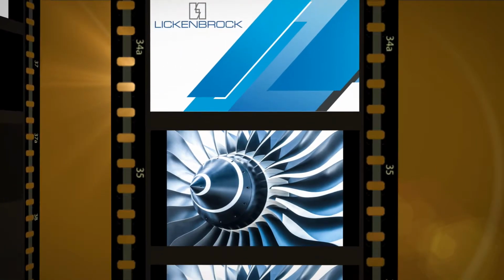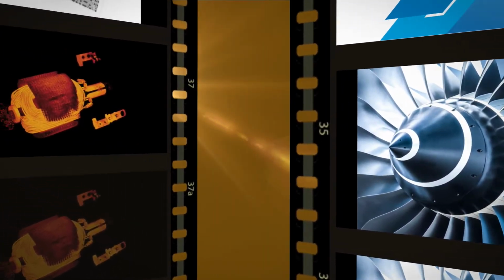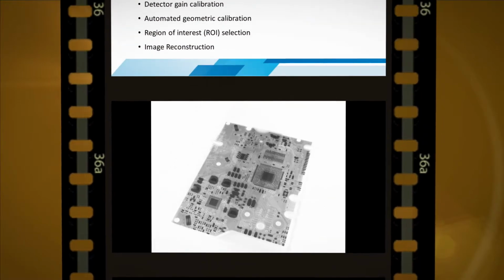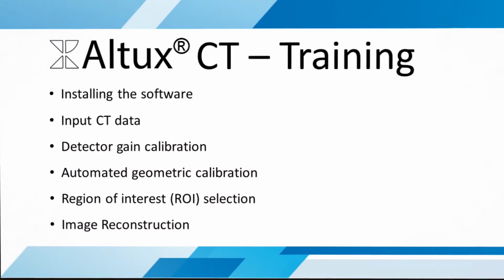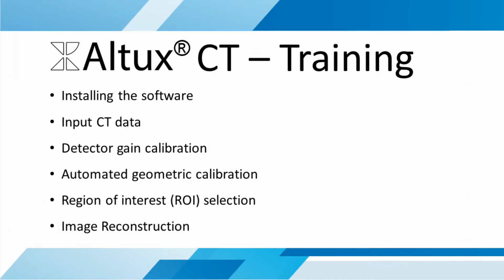Altux CT provides an intuitive graphical user interface to process CT data. The purpose of this video is to train a new user. We will go through the typical workflow of generating a cone beam CT reconstruction.